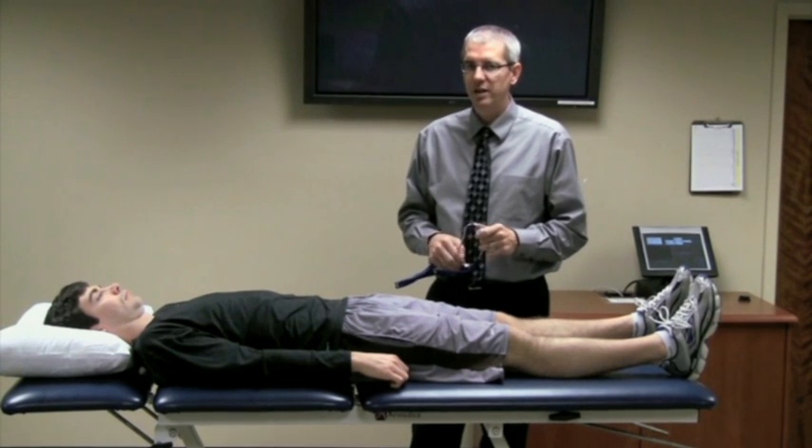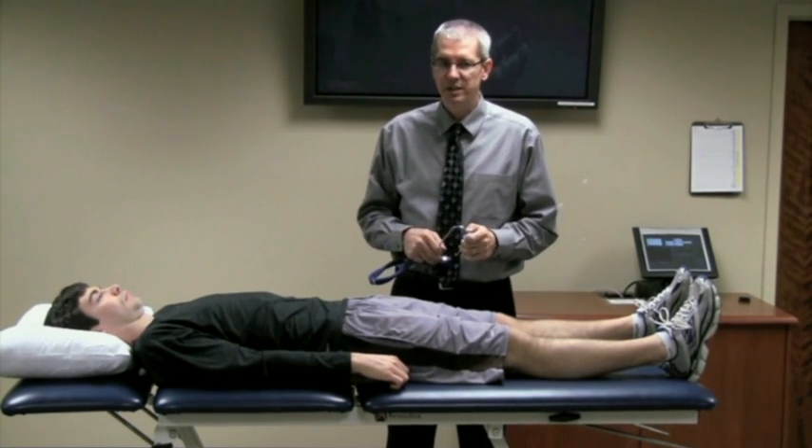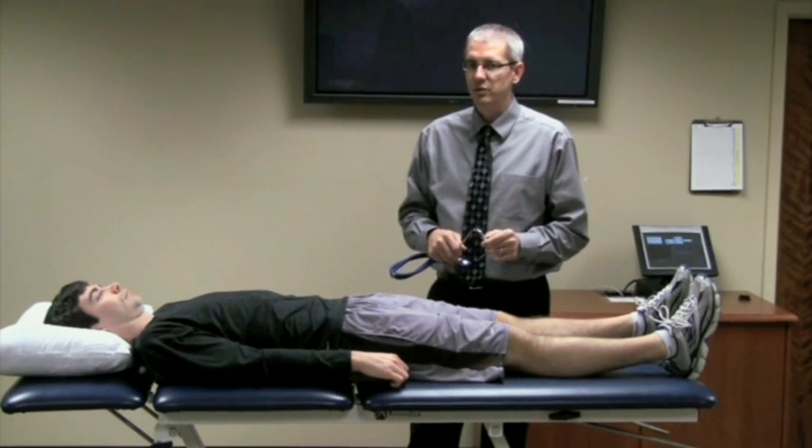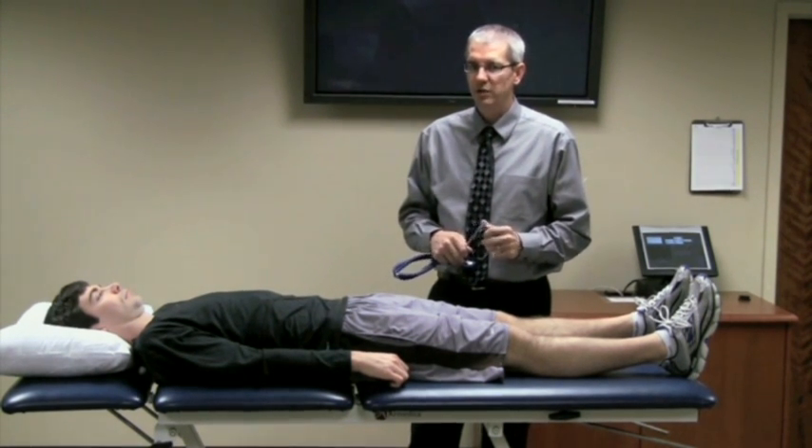A normal response, or a negative test, is a sharp, distinct sound. A sound that is not sharp or distinct is a positive response, or a suspicion of a fracture.